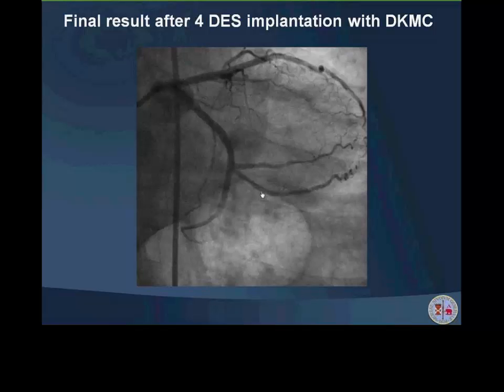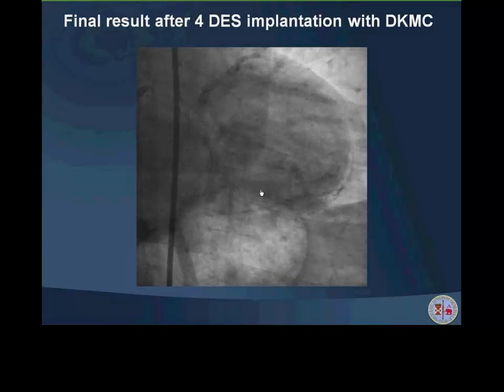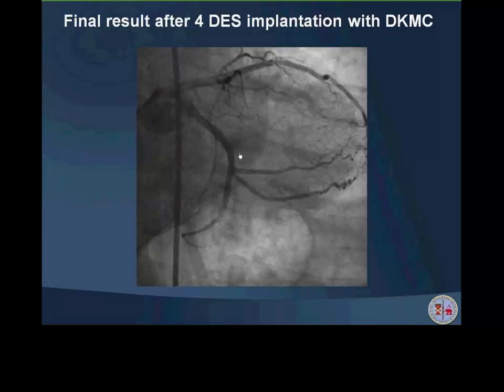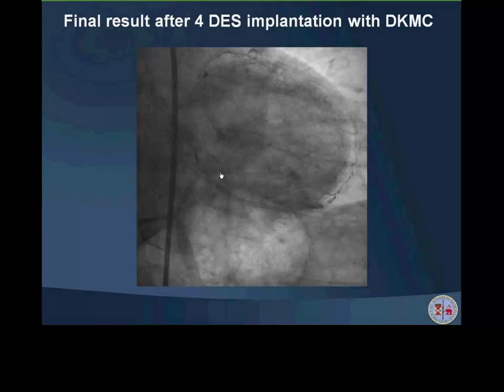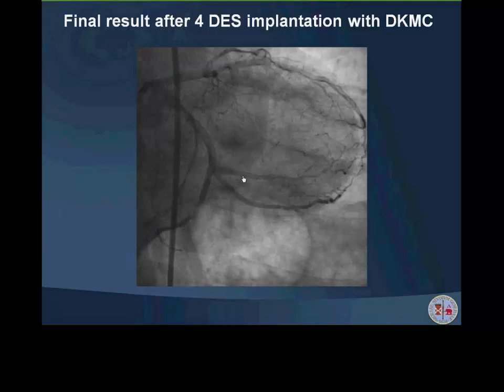And how can you make sure the direction is the right direction? Can you rotate the catheter to make it point towards the true lumen? Okay, I will tell you later on at the end of my presentation, because this NHancer RX does have a knob that you can twist, and you can identify the marker on the side of the branch of the microcatheter, and so you might have some hint in redirecting the wire.